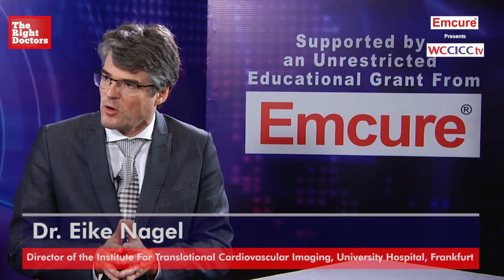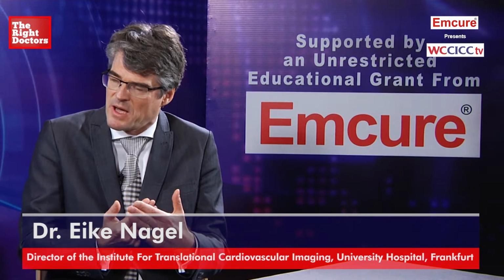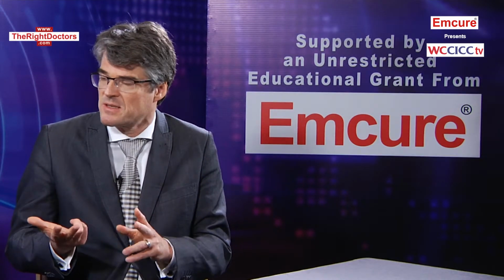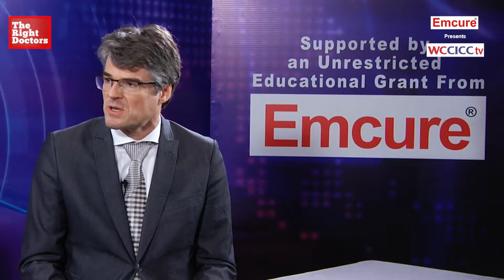With magnetic resonance imaging, we have the ability to look into the myocardium by using late enhancement, which marks irreversible damage, and see whether the reduction of ejection fraction or the increase of volumes is due to ischemia, DCM, myocarditis, or other more rare causes. Similarly, if the ejection fraction is still normal, we can see the diffuse changes of the myocardium. For example, in patients with HFpEF, do we have an underlying problem such as diffuse fibrosis, inflammation or microvascular disease, which can all explain the symptoms, and that is not found if you don't use cardiac MR.